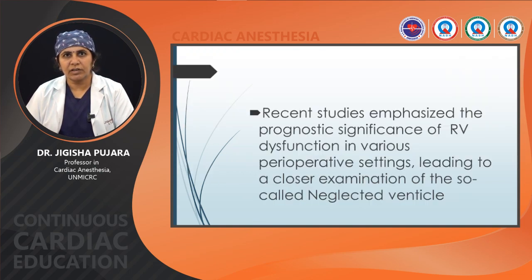Recent studies emphasize the prognostic significance of RV dysfunction in various perioperative settings, leading to a closer examination of the so-called neglected ventricle.